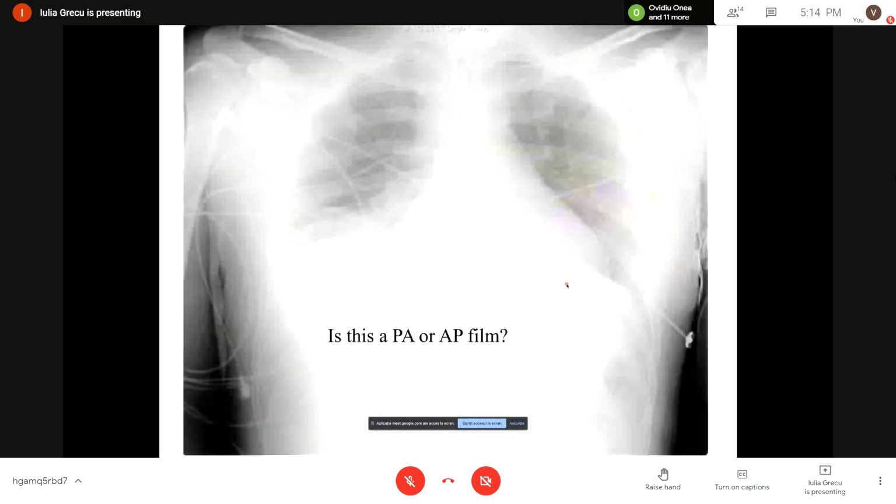So when we position the patient on his back because he's severely injured, or he's lying in the ICU or on the therapy bed, or he's intubated, or different kinds of procedures are being done to him, if he lies on his back in a supine position, then everything will change in his chest.